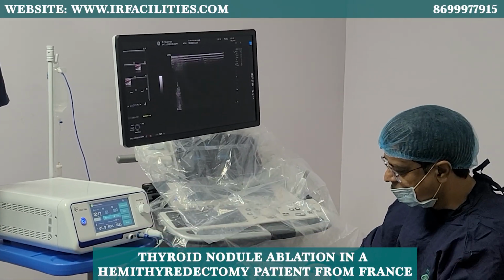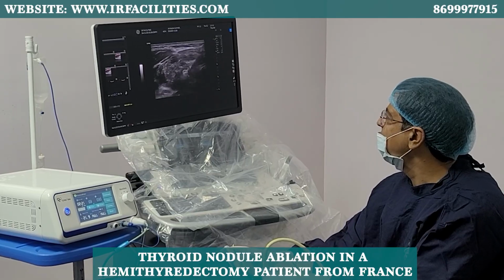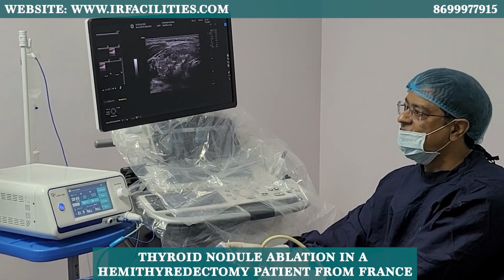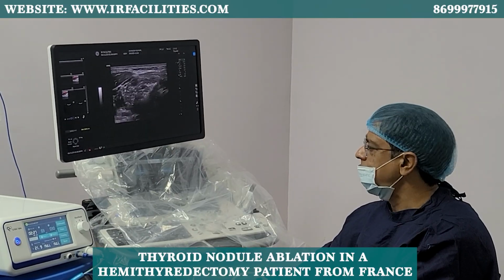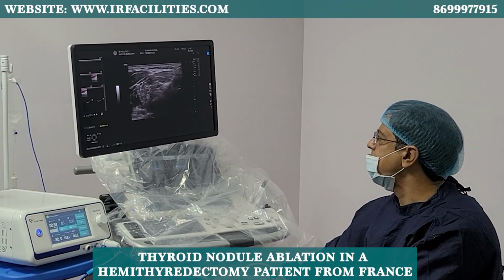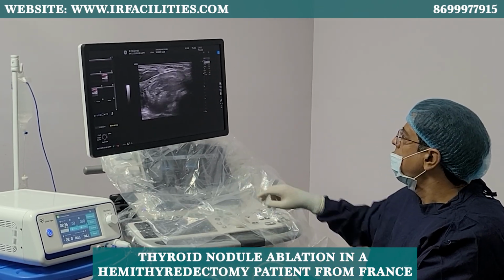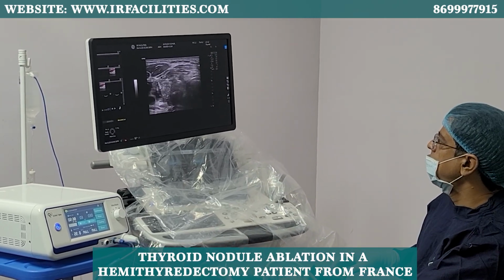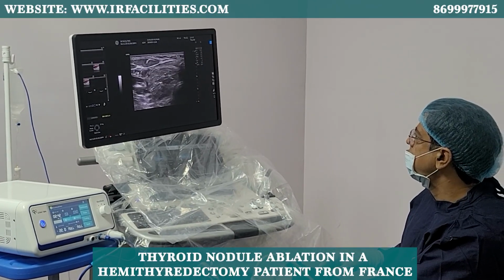Do you have any trouble? No? I think this is how it has to be. How can we give it? I just gave you 20 mics and can go up to 100 mics for pain. But if it is too painful, a little bit is okay, because it's awake surgery. So we just want to ensure that you wake up and are quickly away from the hospital.